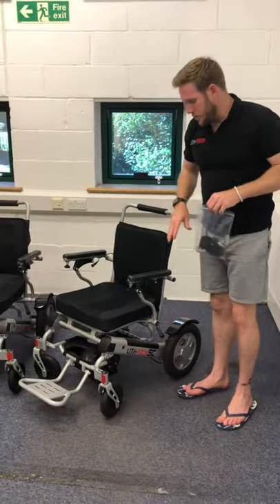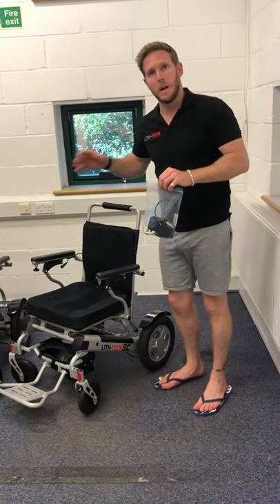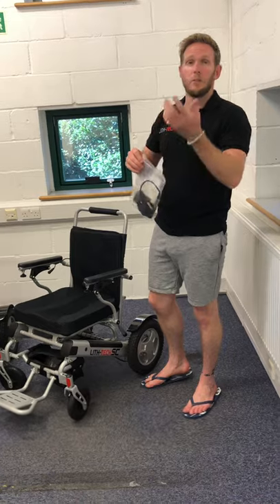There is a left and a right hand battery, so do make sure the left hand battery goes in the left side and the right hand battery goes in the right side — otherwise they won't lock in and will just pop out.